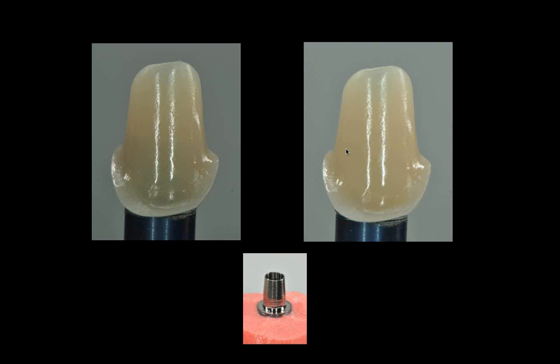Now, the next two crowns are abutment crowns. And when you look at these abutment crowns, you will see something very interesting. You see that this one looks gray and this one doesn't look gray. And I want to show you in the next few slides what I do to stop my abutments becoming gray. Because this is still a problem, that very often your abutments have a tendency of picking up the color from the titanium base underneath, or if you have a titanium base in the patient's mouth and you're just putting a thin crown on it, basically it tends to look a bit gray from underneath.